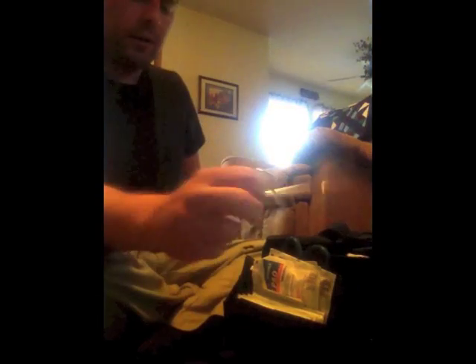Anyway, I also have some scissors, you know, to cut bandages, whatever. I have one of these, and that goes in another slot. I also have another pen light, this is what I was talking about. Sometimes the battery's a little messed up on here, the light. But this one's replaceable. I think it's a AAA battery. These ones you can buy in a medical store, scrub store. So there's that one.